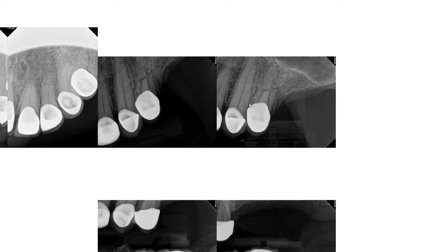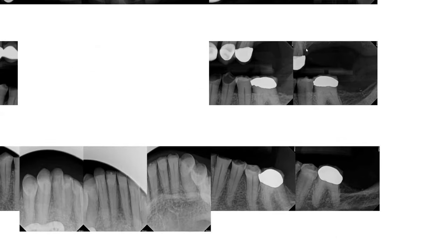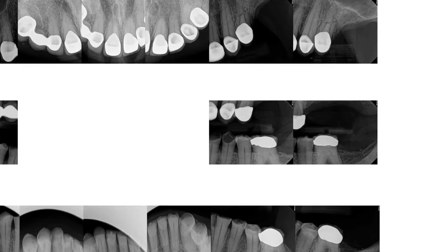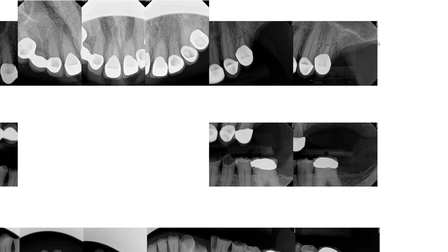Luckily, from what I can tell, there's no evidence of severe bone loss on this particular tooth. This is not the ideal bite-wing radiograph, but you can see that the crest comes up pretty close to where we expect it to be. Just distal to that, we've lost a significant amount of bone, as we would expect — the ridge undergoing normal atrophy after the extraction.